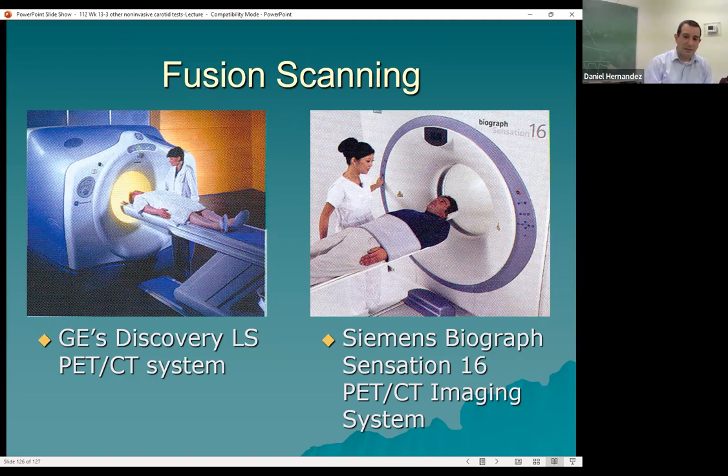I don't know if that's something that Christiana does, or if it's common practice for them, or if they get the patients coming directly from nuclear medicine or not. I'm actually going to ask one of the nuke med professors if that's something that the echo techs do, but that's something that they did in New York to protect themselves, long term. They knew that these patients were hot. They came from nuclear med, and they would wear lead when they were doing the echoes. So just something to keep in your mind.